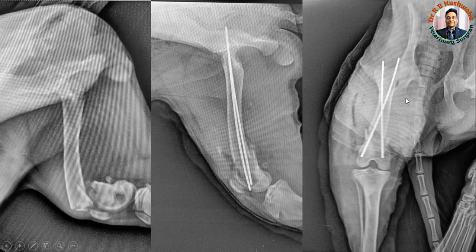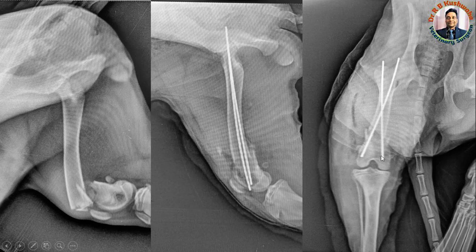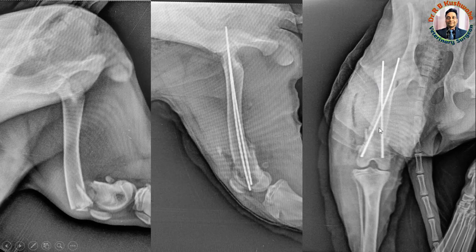This is the craniocaudal view of the same femur bone. You can appreciate the crossing of the K-wires — one inserted from the lateral epicondyle and one from the medial epicondyle. When you insert the pin from the lateral epicondyle it will emerge medially, and when inserted from the medial side it will emerge laterally. Both pins emerge from the trochanteric fossa.